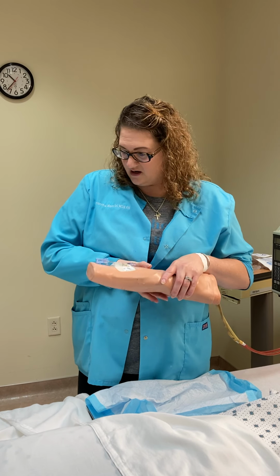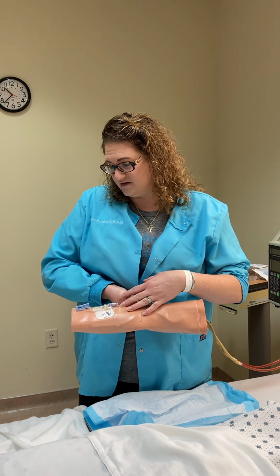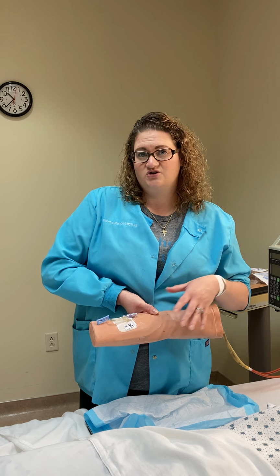And then the other one is extravasation, which is when a vesicant medication, a vesicant is something that's irritating to the veins, essentially infiltrates, but it can open up or it can become necrotic. So there will be swelling, pain, stinging, burning at the site, and there are usually different regimens for treating those. So that's something you would want to follow your facility policy for.